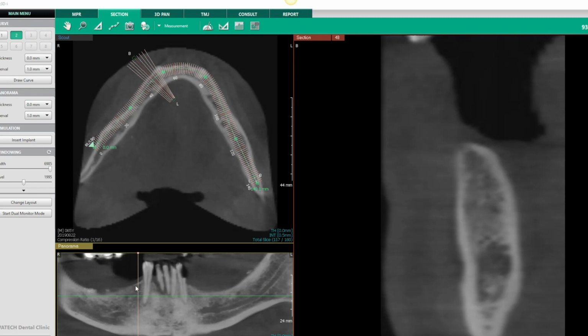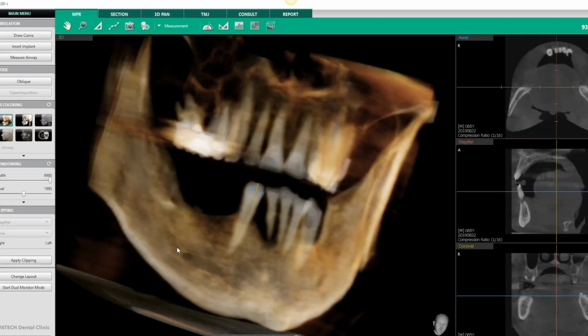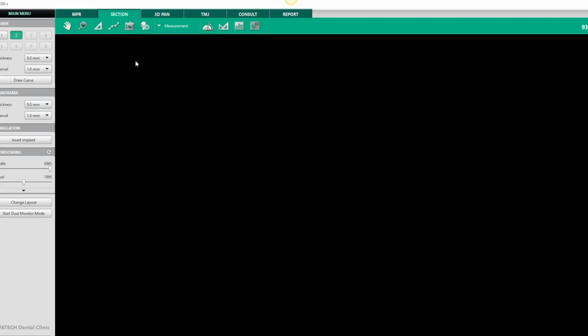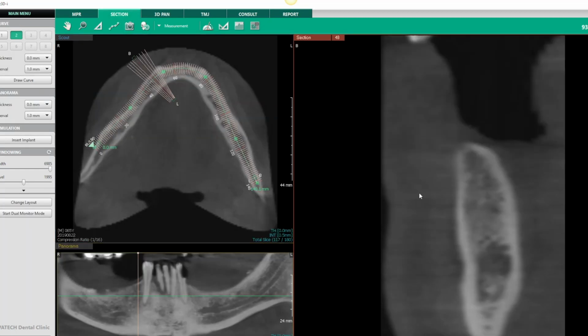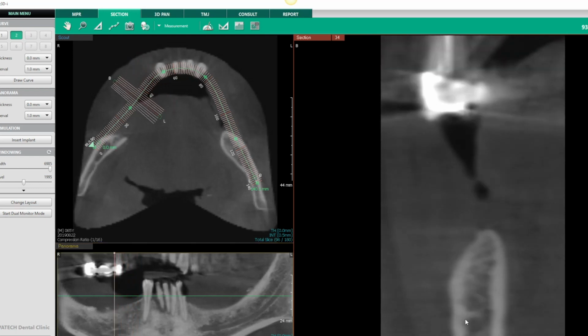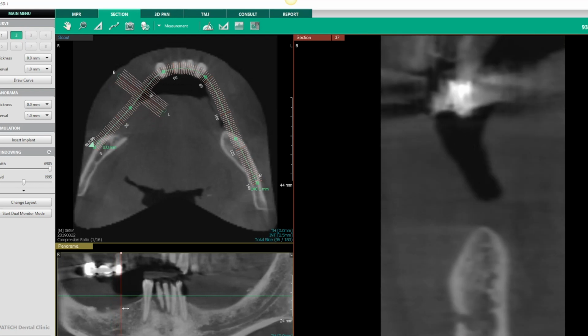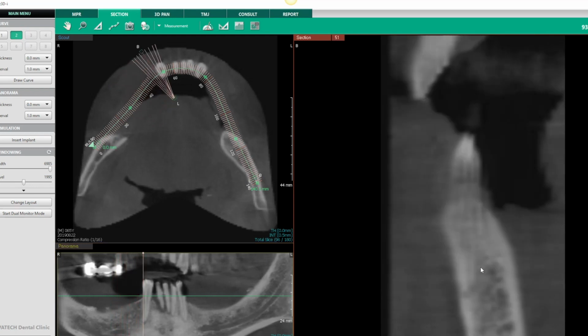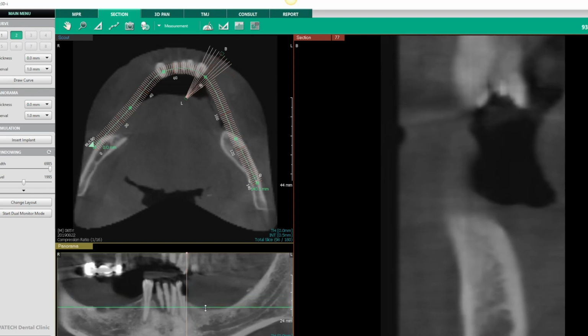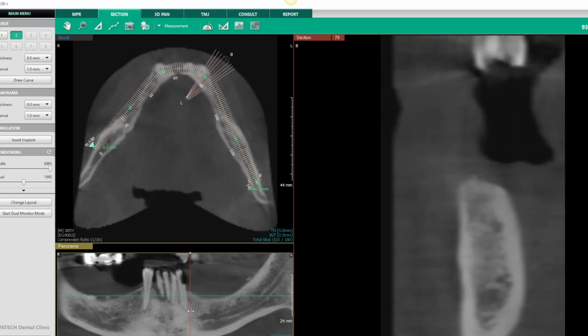This is a 3D scan, and typically you may not see this at other offices, but this 3D scan is very important that we take a look at so we can see the overall dimension of the bone. What we're seeing here is a side profile, and what we're really looking for is vital structures such as your nerves, and also the density and the thickness of the bone. Those are very important things that we'll be looking at when assessing your candidacy, whether the all-on-4 solution is right for you.